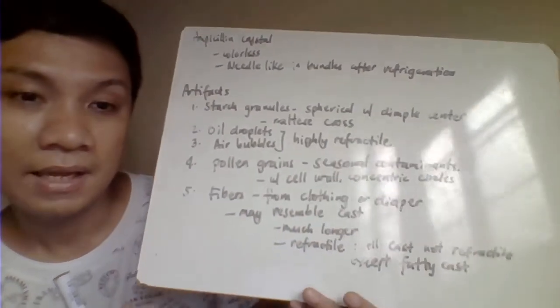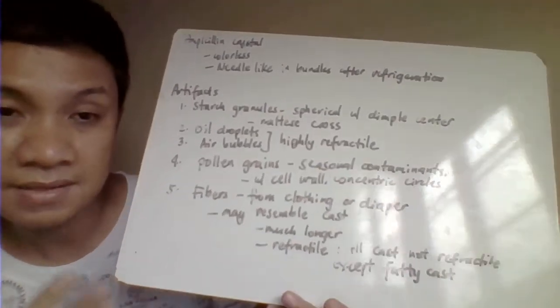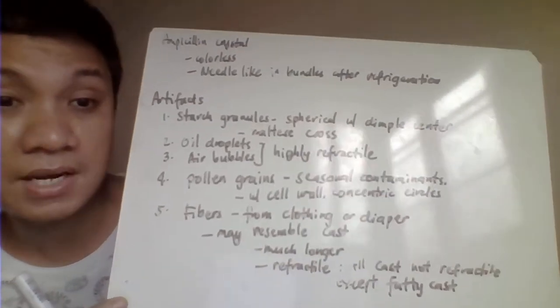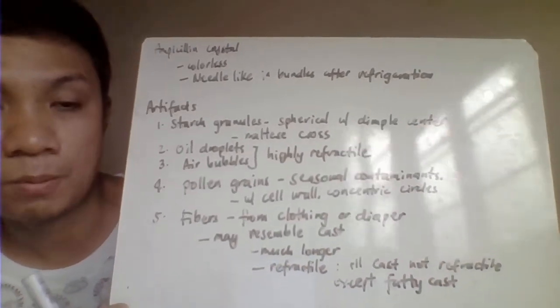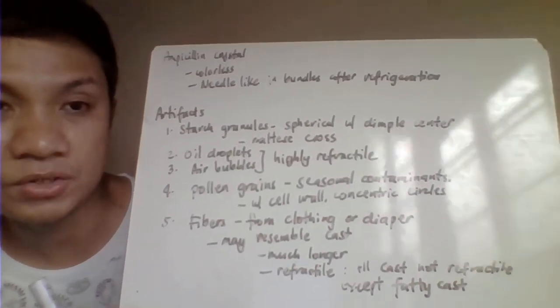Okay, so for this topic, you just need to identify the significance, the shapes, the morphology, and of course you also need to be familiar with the actual morphology under the microscope. Okay, so that's all for our microscopic examination. Okay, thank you.